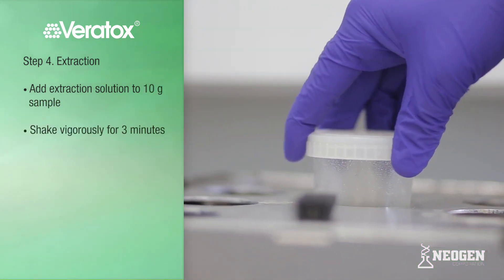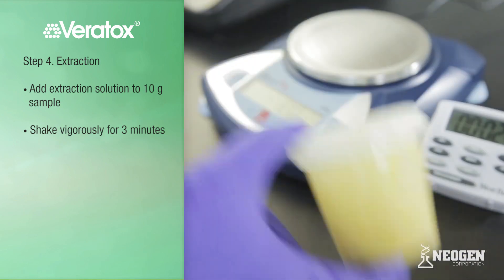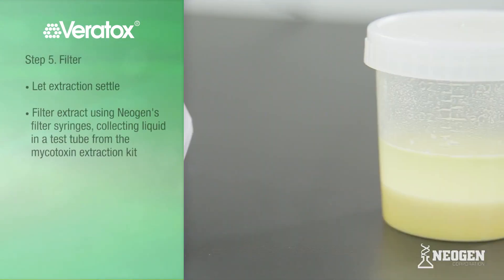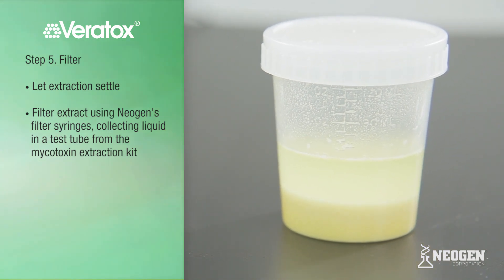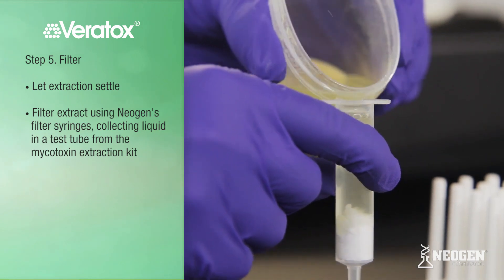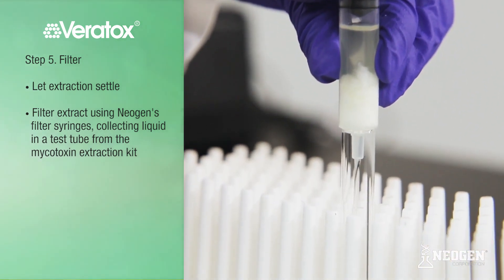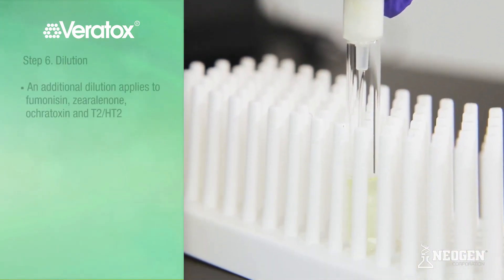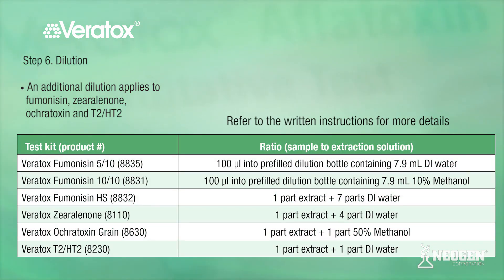Place the extraction cup on the rocker shaker and shake for three minutes. The alternative is to shake vigorously by hand for three minutes. Once finished shaking, let it settle, then filter the extract using Neogen's filter syringes or Whatman number one filter paper, collecting liquid in a test tube or cup. An additional dilution applies to fumonisin, zearalenone, ochratoxin, and T2-HT2. The Fumonisin 5/10 and 10/10 kits are provided with pre-filled dilution bottles, while other kits can be diluted into a clean sample dilution tube. Refer to kit instructions for specific details.